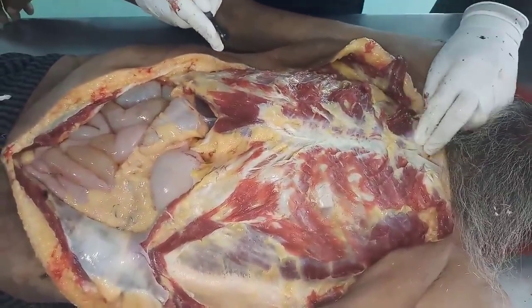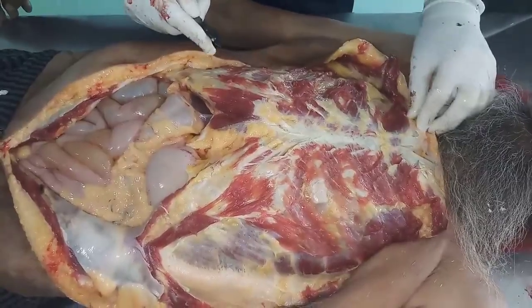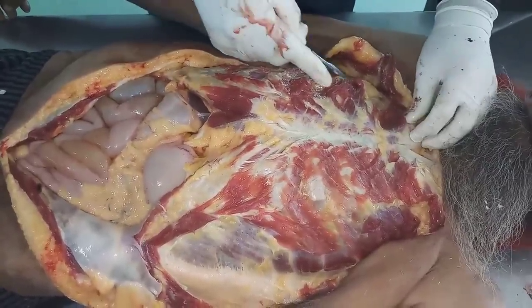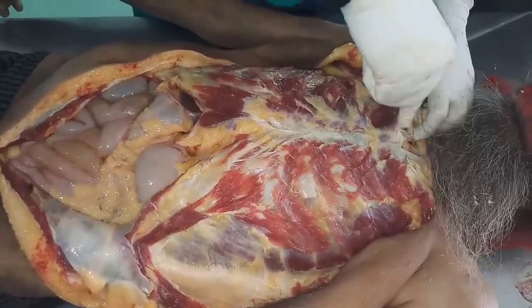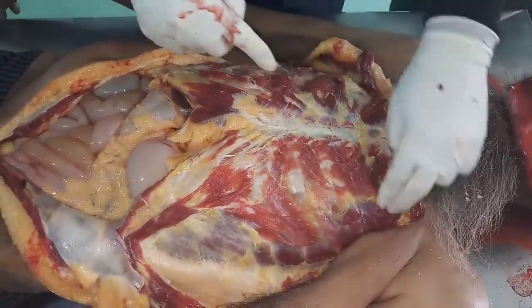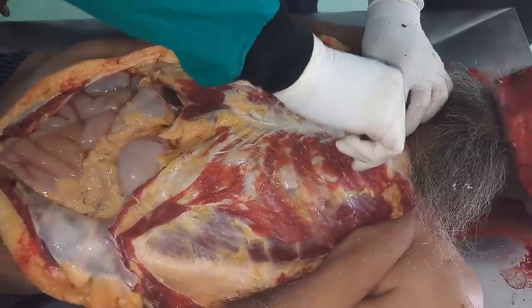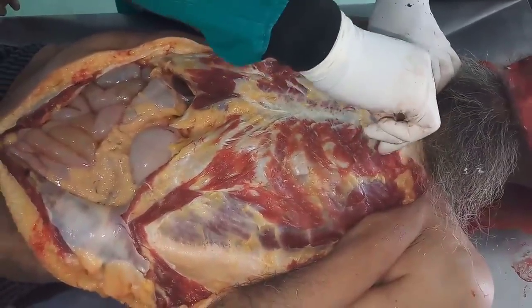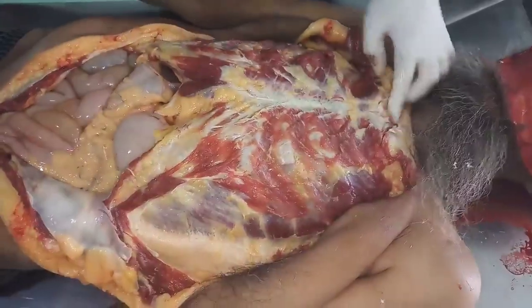So clavicle, sternum, the sternoclavicular joint. I will just open this sternoclavicular joint from here. The joint seems to be a little ossified as it's an old age person, 82-year-old. This side it is cut, opened. Okay.